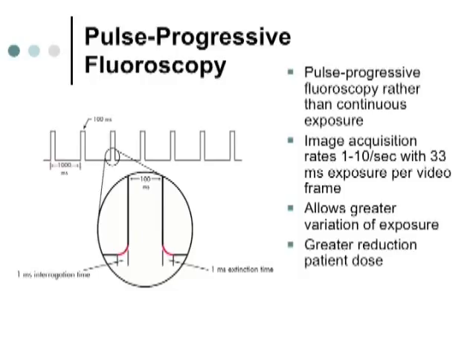Okay, so pulse progressive fluoroscopy is the latest, greatest thing. Everybody loves it because in 1 second, or 1,000 milliseconds, you're only exposing 1/10 of that time, whereas in conventional fluoroscopy, you're exposing continuously during the entire second, giving a patient in 1 second 360 pulses of X-ray with very low MA, very low current.